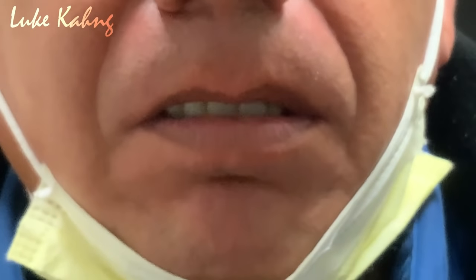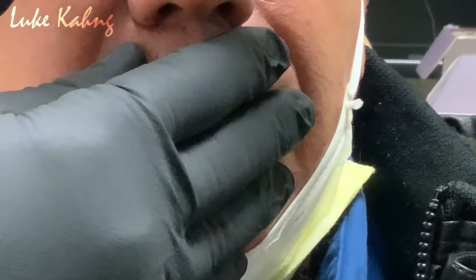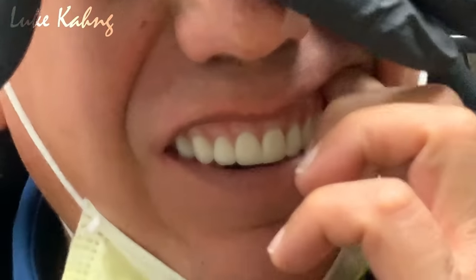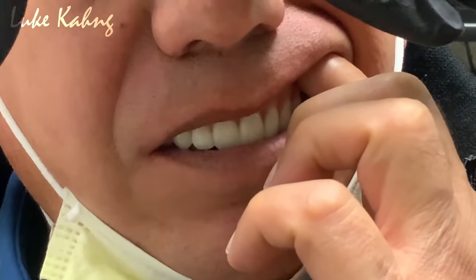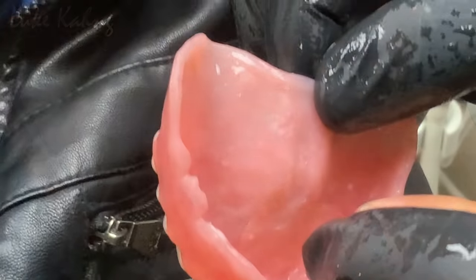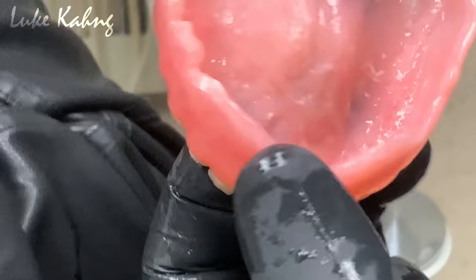How's it feel? There, just getting used to it. Okay, close. Okay. We give you 10 seconds, something later. Almost there. So, we're getting closer, right? Just right here. He's feeling a tiny bit on the undercut there. Okay. Then we trim it down. Okay.